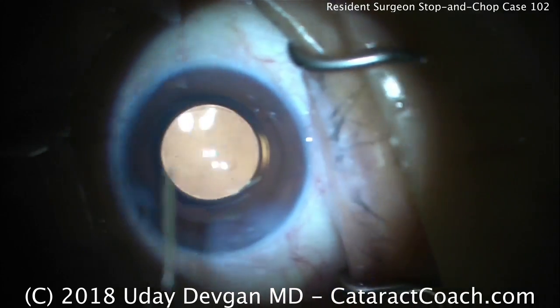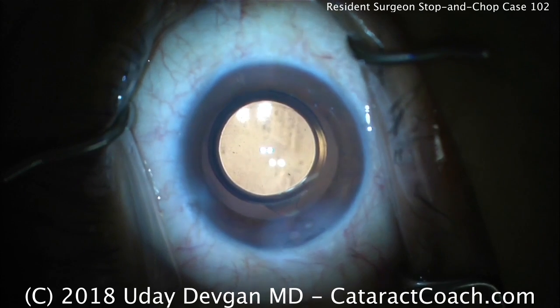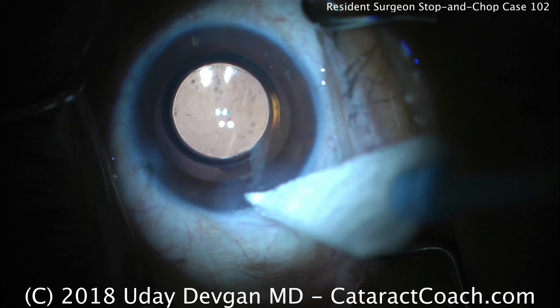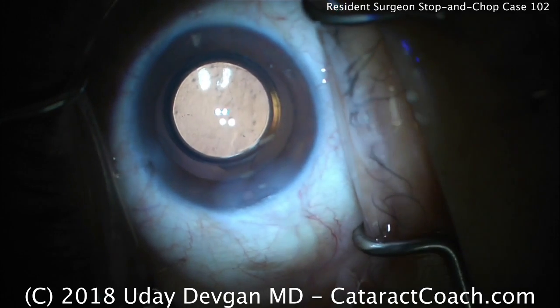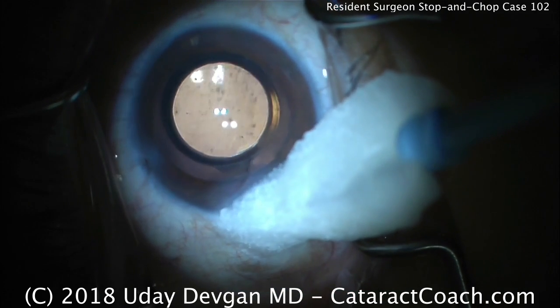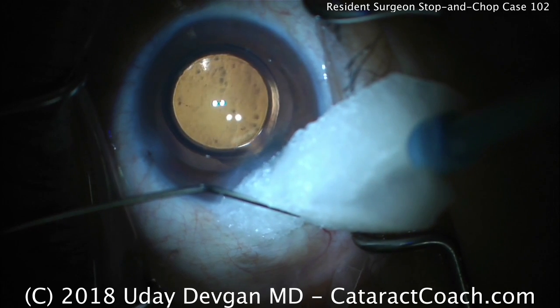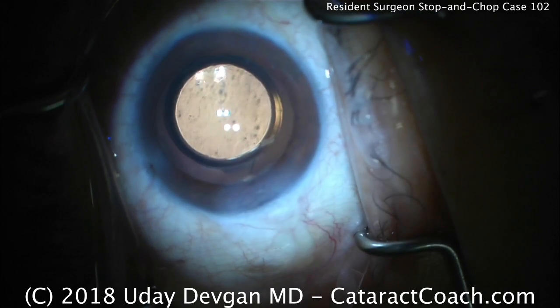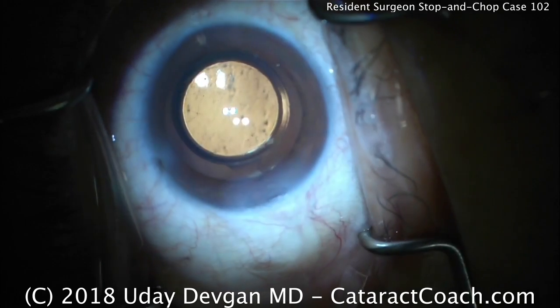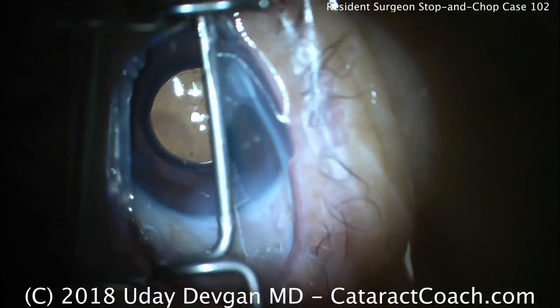In summary, this resident did a very good job with the surgery using a stop-and-chop technique. Areas for improvement: one, consider using a dispersive viscoelastic to better protect the corneal endothelium. Two, during capsulorhexis — done very well — maybe fewer grabs with a little longer travel before re-grabbing. Three, during nucleus removal the grooves were good but start the groove a little more in the sub-incisional space for longer groove length. The cracking was fine; with chopping, the resident figured out to grab the corner rather than the middle of the nuclear piece. Irrigation-aspiration was great and cortex removal was done very well. Good job to this resident — I look forward to operating with you.